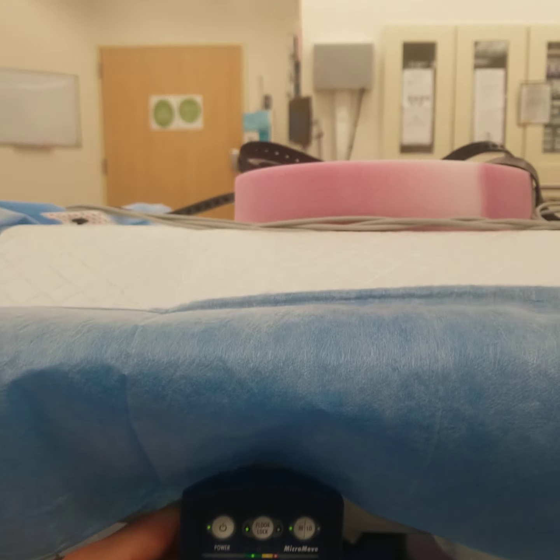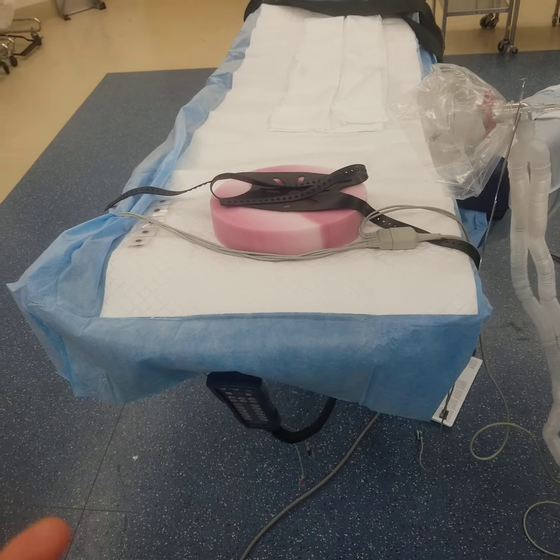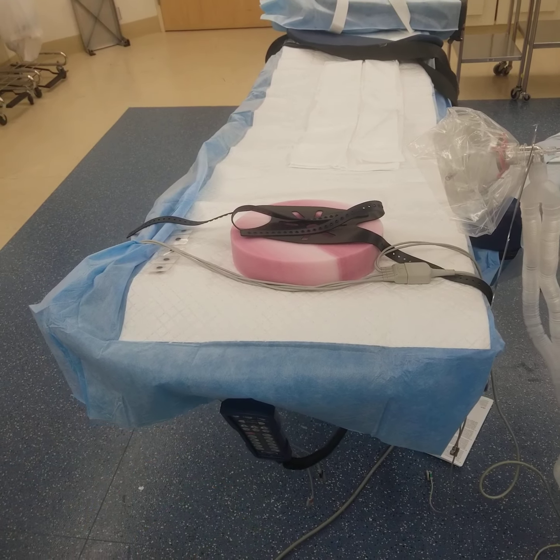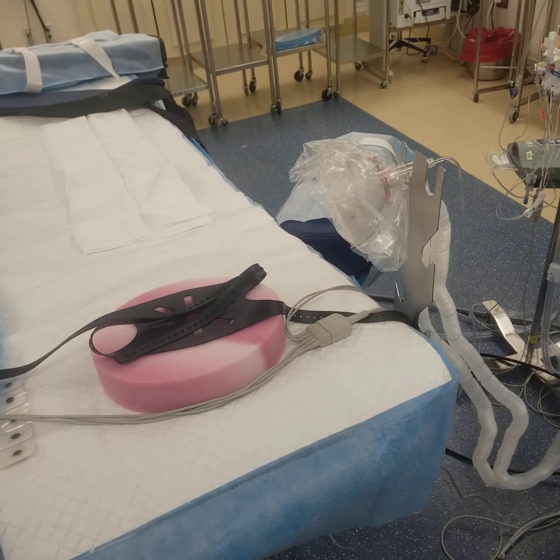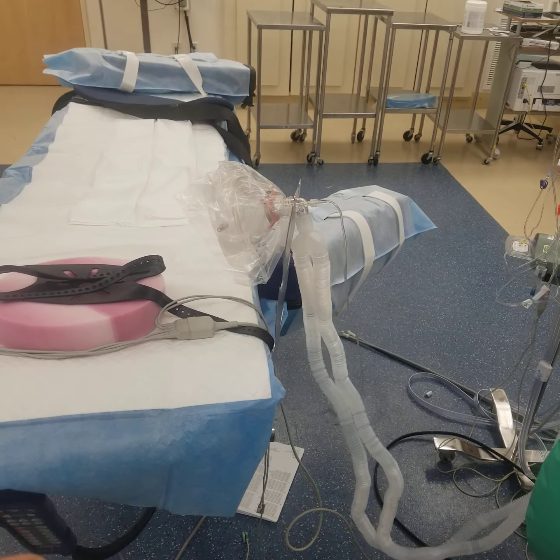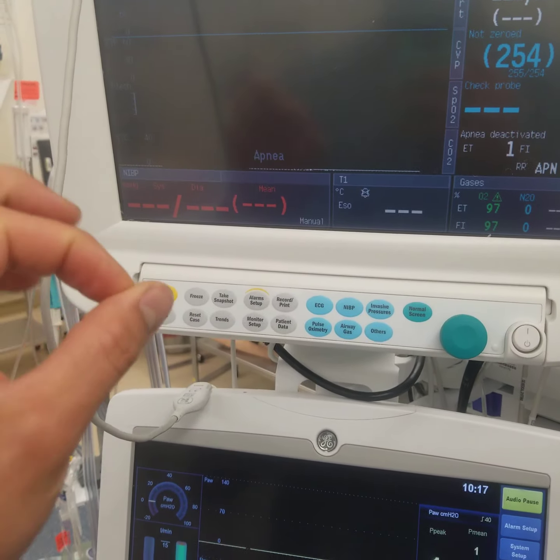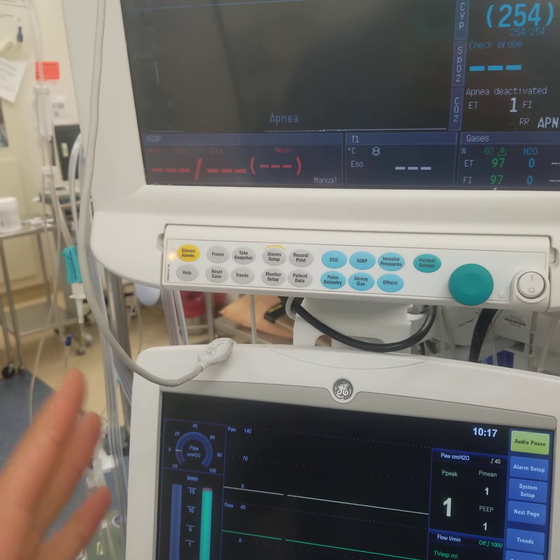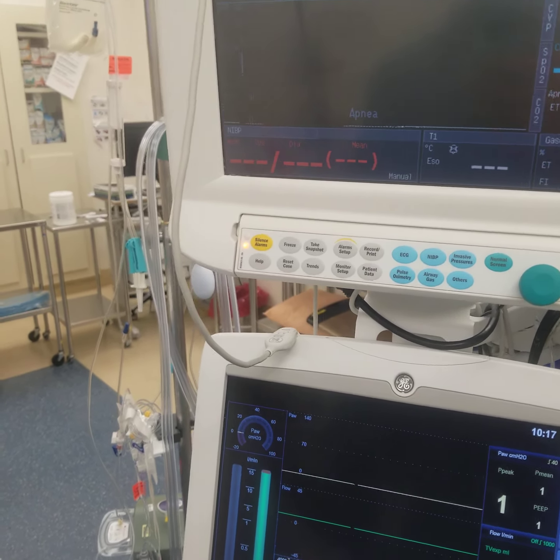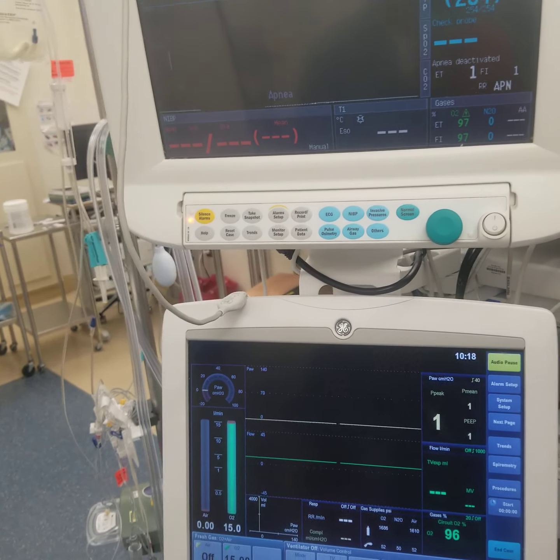So we're just putting the head of the bed up like 20 to 30 degrees so that they have less atelectasis, less VQ mismatching, especially as you age and stuff after 40, you start to have that when you're flat. So now they're pre-oxygenating, their vitals are on. I'm cycling my blood pressure every 2 minutes, sometimes 1 minute during the induction because it really tells you a lot about what's going on before it's been 5 minutes and now your pressures are in the 60s.